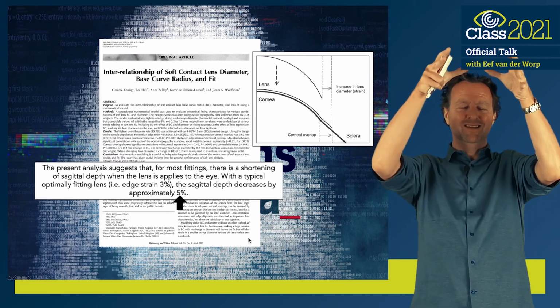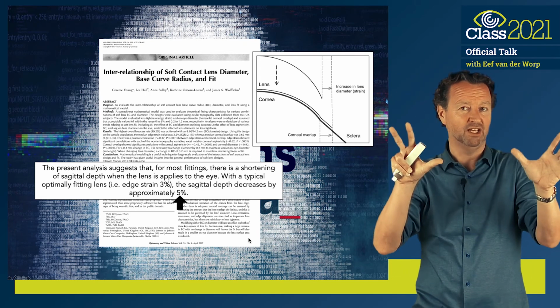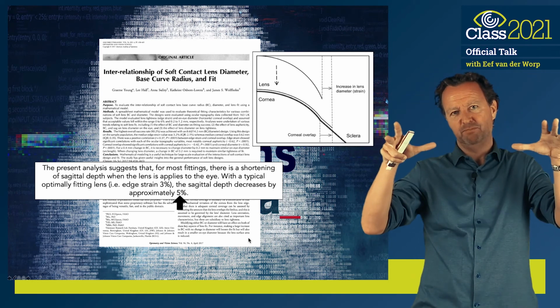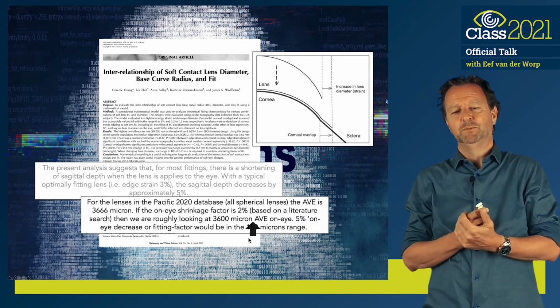So in essence, a soft lens has to be steep, it's going to flex on the eye, and in a different meridian it may flex differently. I don't want to make it too complex, but let's take a look at the average for now. It's going to flex by X, and then the lens diameter is going to increase by X. And how much is that?